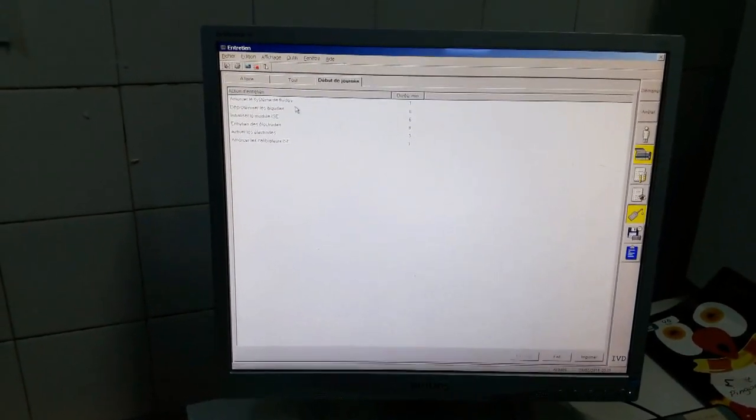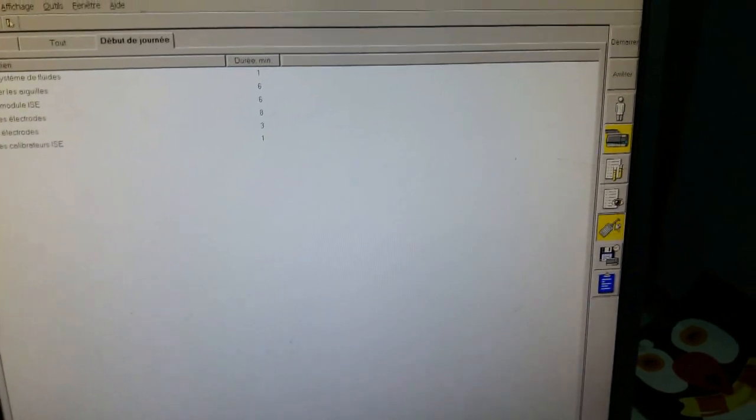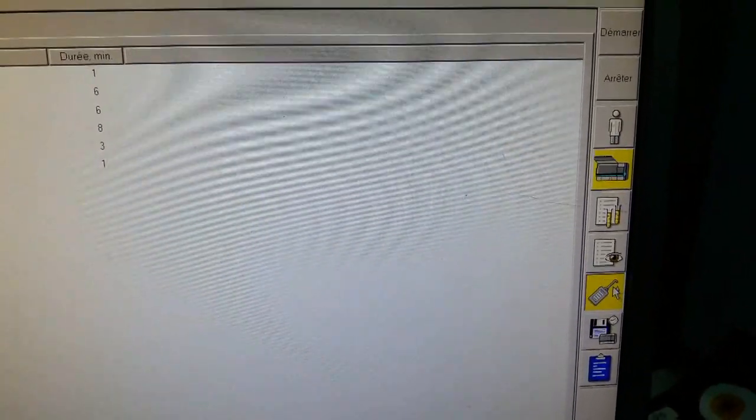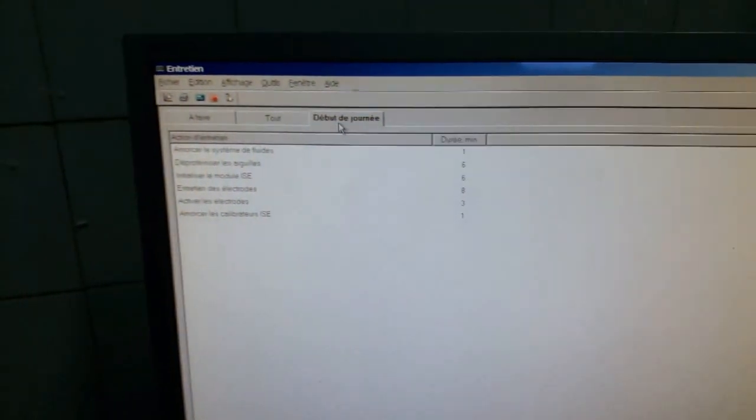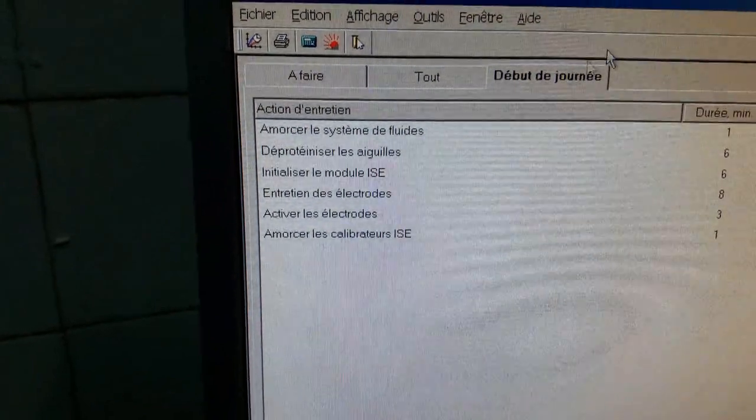Après l'étape de la vérification, on peut commencer la maintenance. On appuie sur la septième icône. Ces actions d'entretien se présentent ainsi : 1, 2, 3, 4, 5, 6 — six étapes.